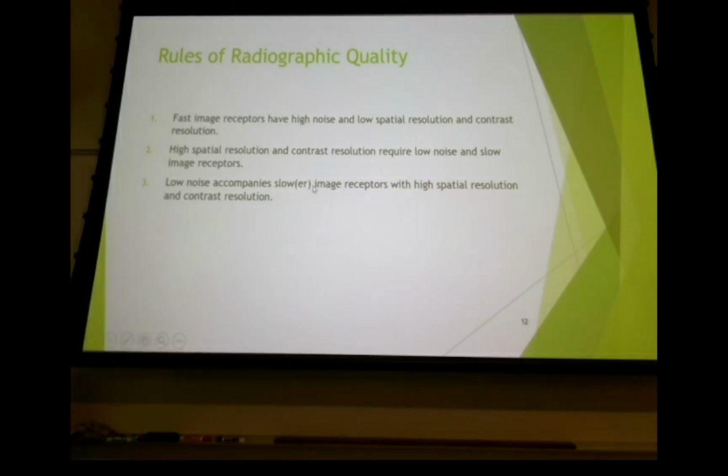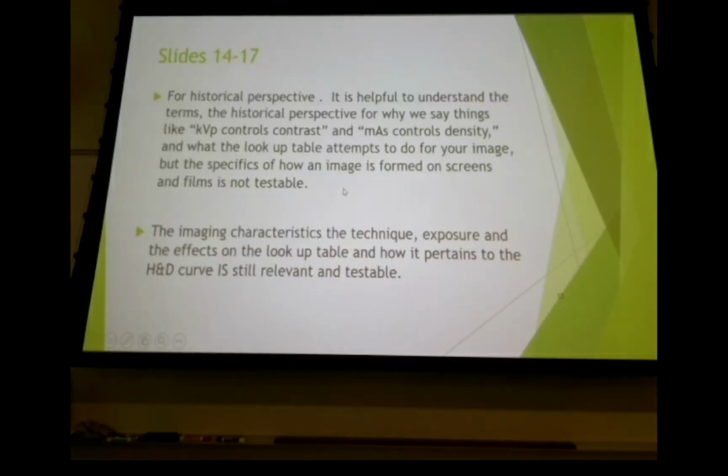You know, we desire the high spatial resolution. It's a little bit lower than what it was with screens and films, but your eyes can't pick it up anyway, so does it really matter? Especially if we introduce such a high contrast resolution that you can bring out those structures and see them a whole lot better. And the answer is really fundamentally no. So our superior contrast resolution sacrifices a little spatial resolution. We're not using slow image receptors anymore.